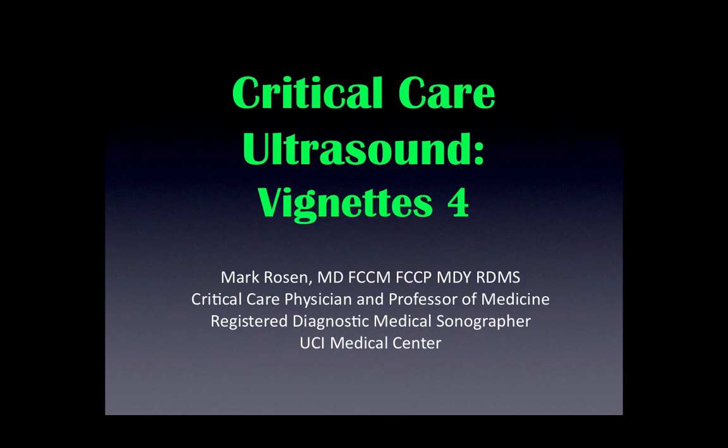This vignette, like all others, is from a real patient and serves to illustrate how ultrasonography can be useful in the intensive care unit or the emergency department in making clinical decisions and diagnoses.